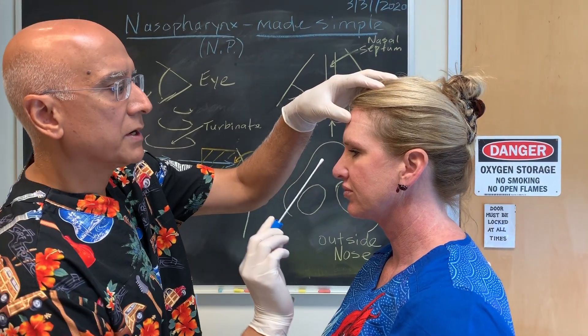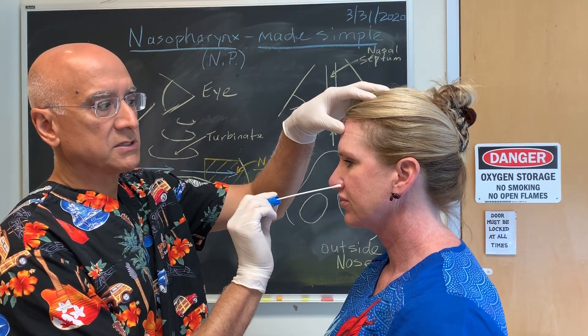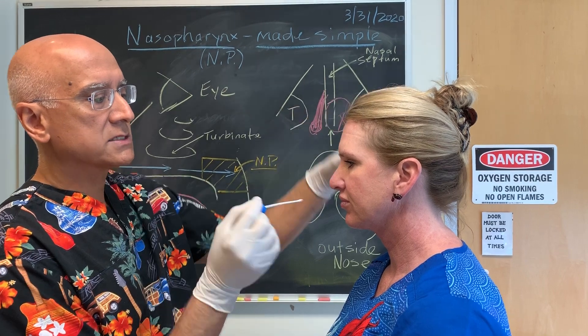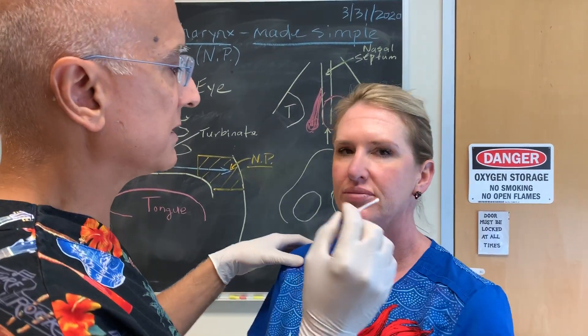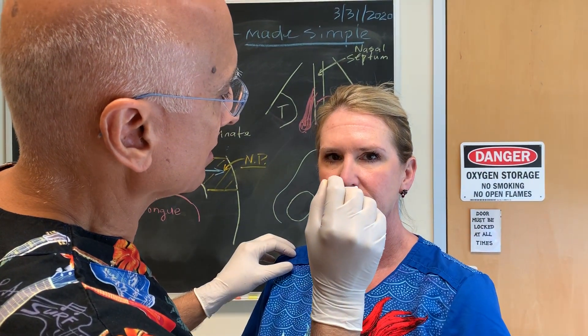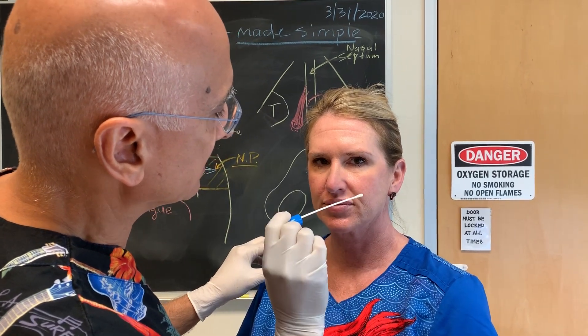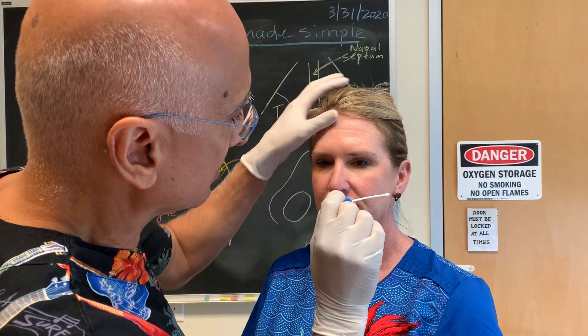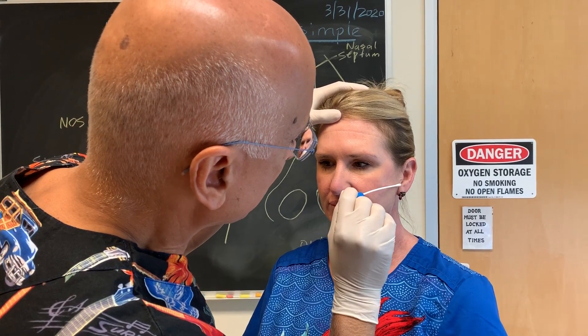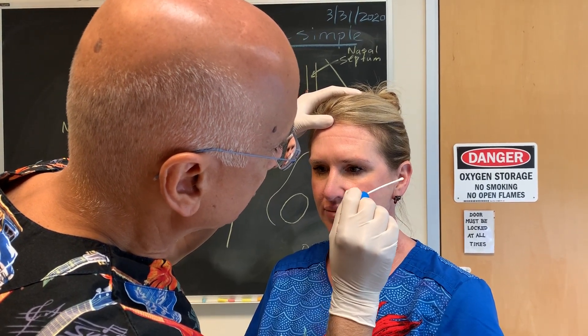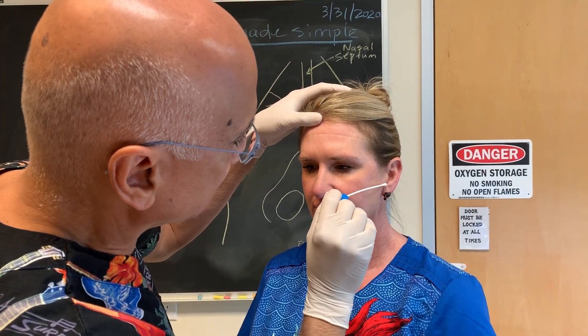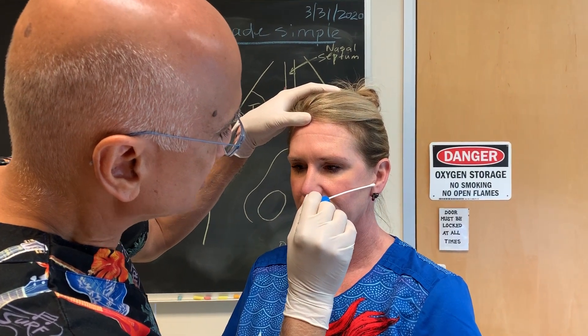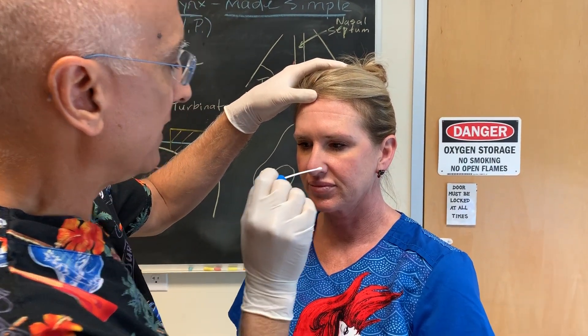So if you look towards the camera, Danny, you want to go straight in and all the way in. You don't want to go up, you don't want to hit the septum, you don't want to hit the turbinate. You want to go straight in along the floor of the nose and the floor of the nose would be right about parallel to where the bottom of the tragus is, which is this part over here, the bottom near the bottom of the ear. So that's your trajectory, straight in and then straight out again.